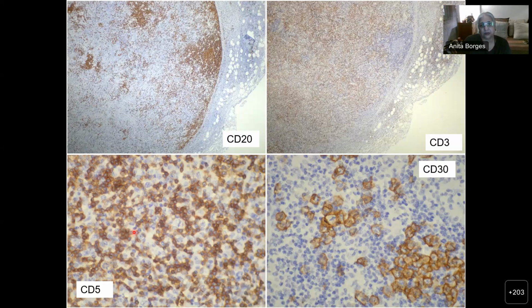You can see here that was CD3. I'm showing you CD5, and look at the CD30. And I can understand why somebody thought that this was Hodgkin lymphoma, because there was a lot of CD30 in this, and obviously that individual was not able to go any further, but with the lymph node having been biopsied, it is showing you a T cell reaction or T cell background, and then you're seeing CD30.